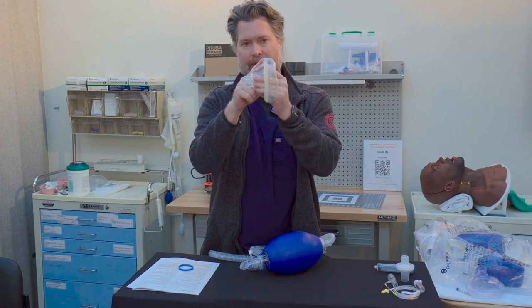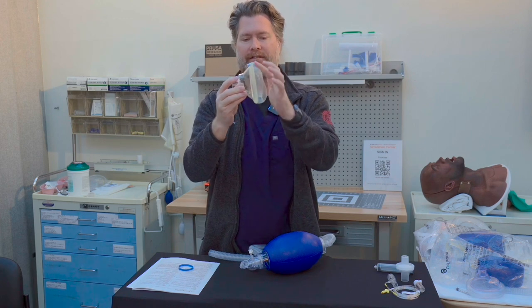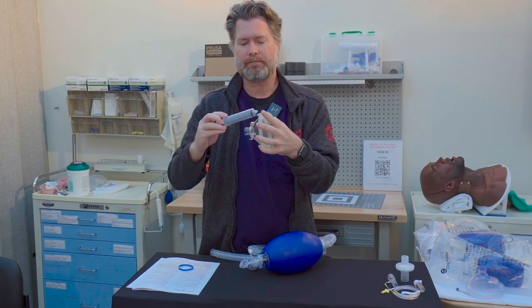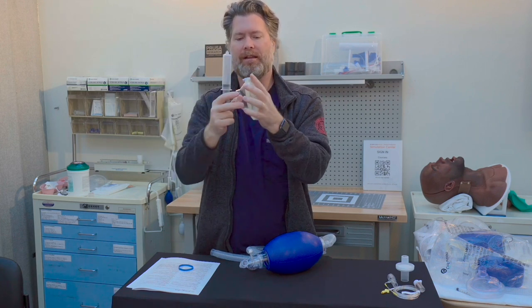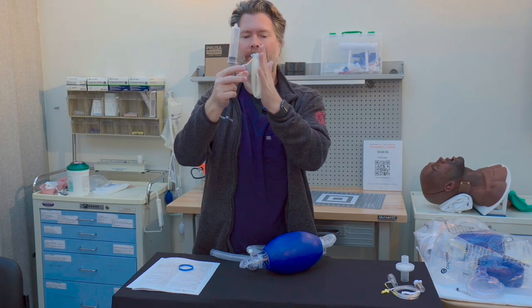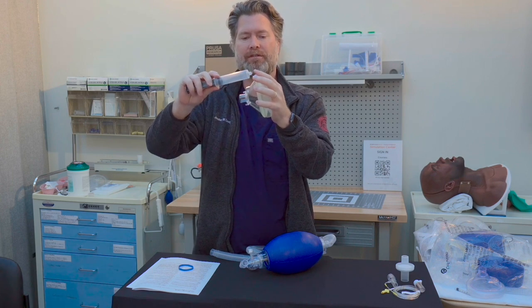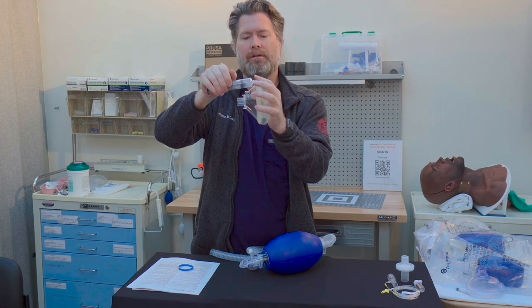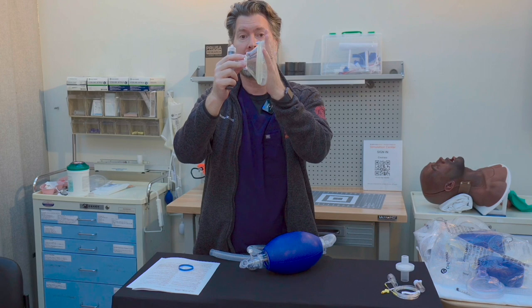There's also this small nipple right here that I think we don't often think about. The seal area is filled with air, which is what allows you to get a good seal to the face. But sometimes the seal isn't great — maybe the bag has deflated over time in storage and you get something much more collapsed where you're not getting a good seal. One way to solve seal problems is by either removing some air or actually inflating it. This small blue valve — it's not a luer lock, you just press down and insert the air. Now you can see I have much more connectivity with the skin.